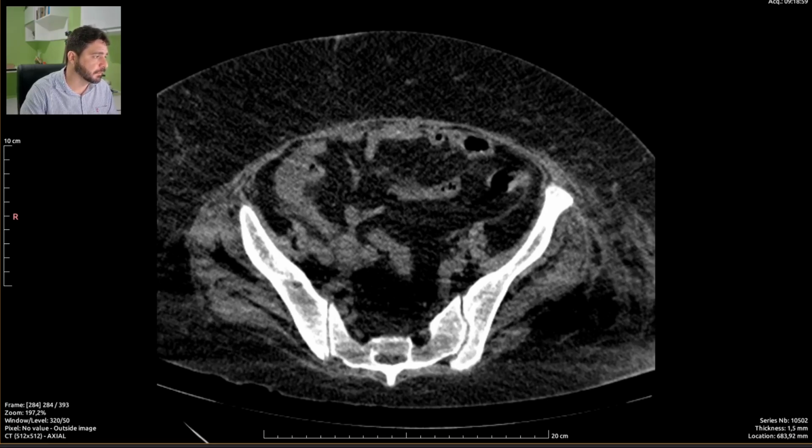So we have finished the superior abdomen. Now we're going to do the pelvis. Same old, same old. Just copy and paste it, just too much. Just a small typing error.